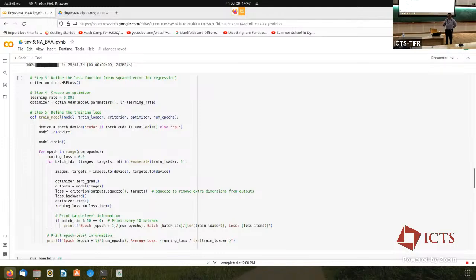But a good thing to start with is 0.01 or 0.001. Most machine learning algorithms, most deep learning with CNNs will use 10 to the -3 to begin. There are ways in which you can find an optimal learning rate and so on. Those are somewhat advanced topics, so we'll not go into that. Just try 0.01 and 0.001.